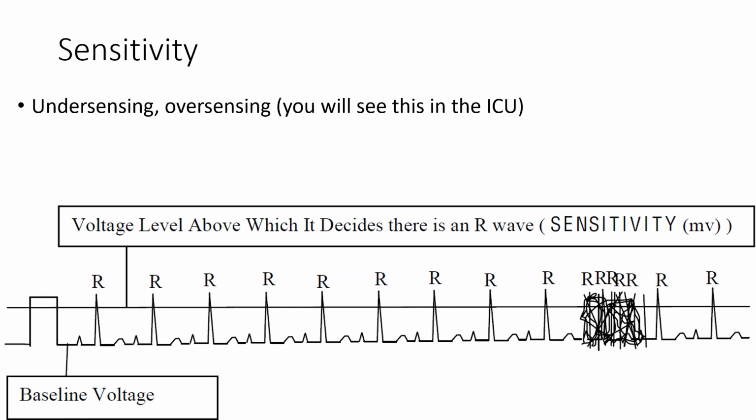is over or under sensing, then they will do the opposite when it comes to pacing, and vice versa, right? So if a patient is over sensing, they're going to under pace. If a patient is under sensing, they're going to over pace. If you walk in and see a patient who is having inappropriate pacing spikes, they are over pacing, then one of the possible causes would be under sensing. So just get that straight in your mind.